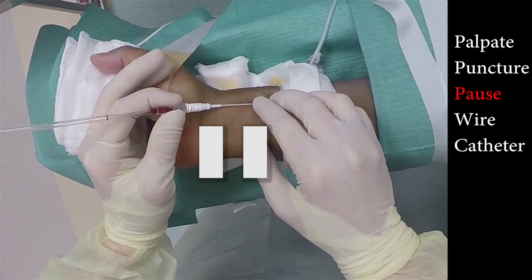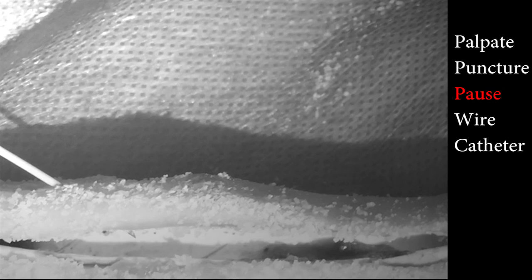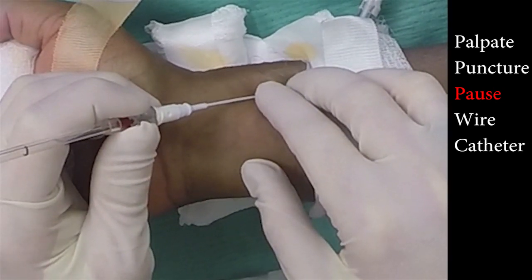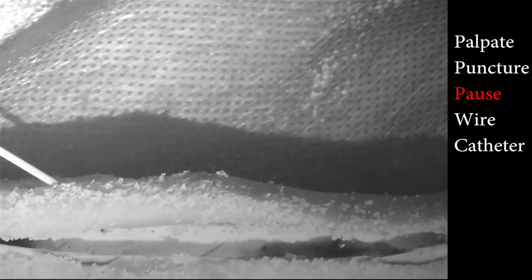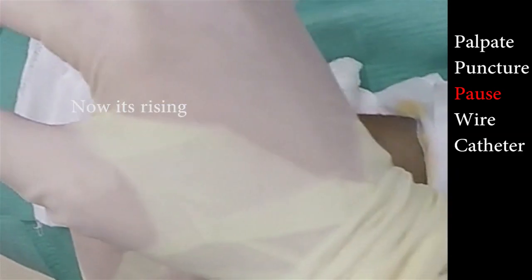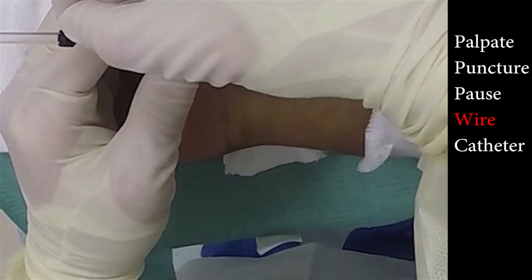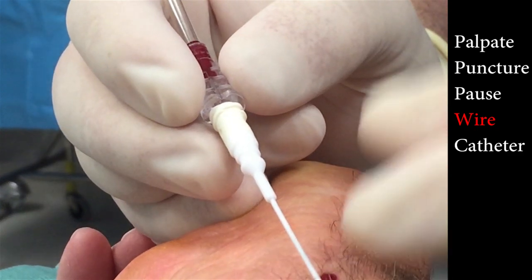Most problems arrive at this moment, and we're going to try to mitigate them right now. It is quite tempting to immediately thread the wire when you finally see blood at your end of the Arrow catheter. We can't just be looking for blood in the catheter — we want rising blood, which can only be coming from a catheter inside the artery. If needed, slowly move the catheter millimeter by millimeter forward, then backwards, adjusting it until the blood again begins to rise. Drop your angle slightly. You can begin step four, insertion of the wire, but if at any time before you try to insert the wire the column of blood ceases to rise, stop and make more readjustments.